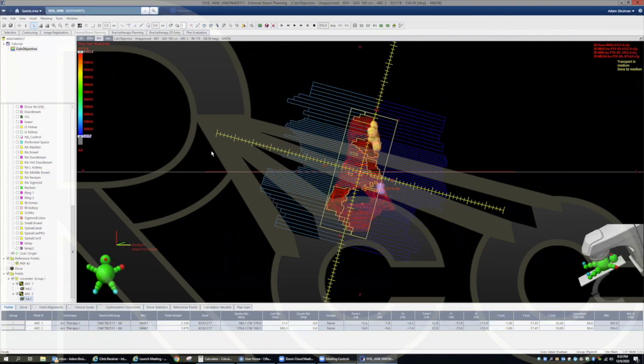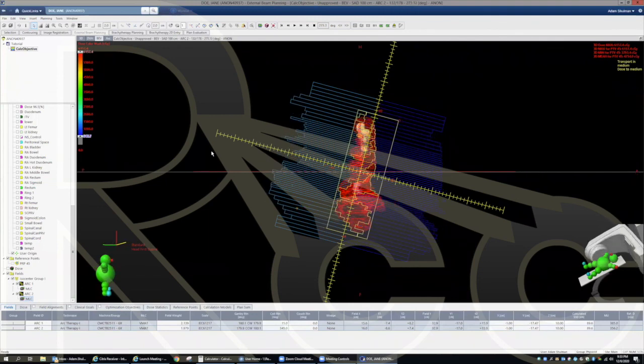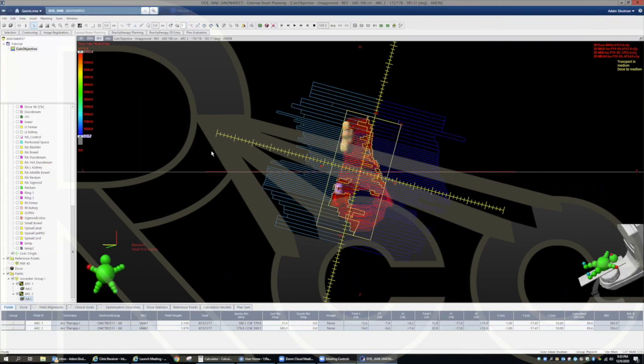What sort of modulation would you start to get concerned? It depends on how well I've commissioned. At all my centers where I've worked so far, we spent a lot of time making sure that we commission things well. And we would test plans like this, so highly modulated. Typically, if my planners are doing what I want them to do, the plans end up highly modulated.